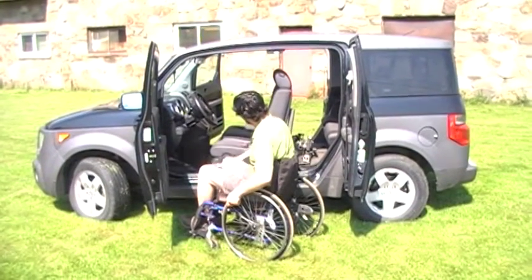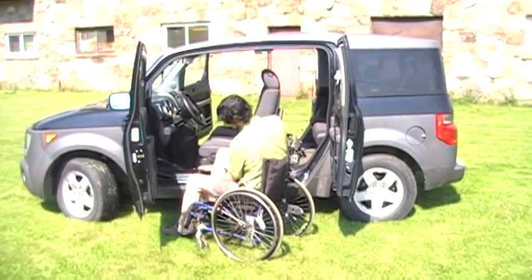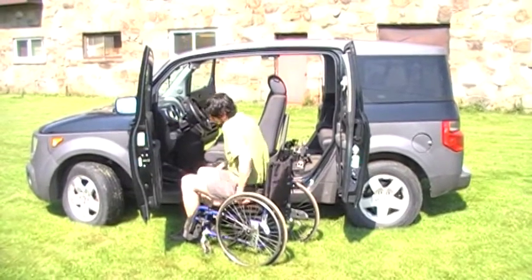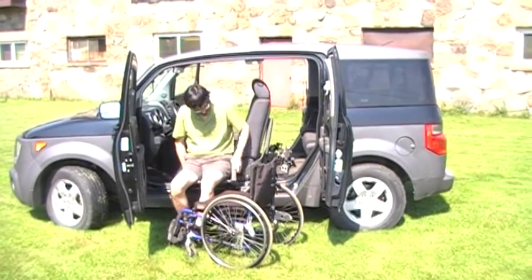This is the Glide and Go Single Fold Slimline with the Easy Stow Wheelchair Lift. First, we transfer onto the Glide and Go seat.